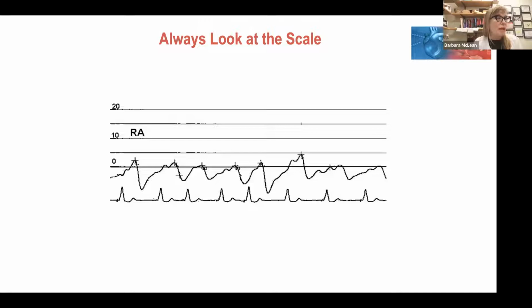And I like to remind everybody that back in the old days, when we put in venous catheters and PA catheters, they didn't have a one-way valve. So if you turned your stopcock the wrong way and your patient had a venous pressure like this, they would suck air into their tubing and get an air embolus. And that was really the number one cause of death with central venous pressure monitoring. Now, we don't have that problem anymore.